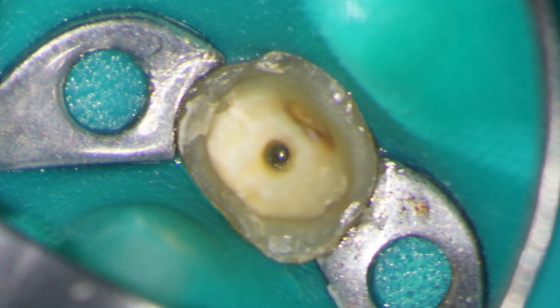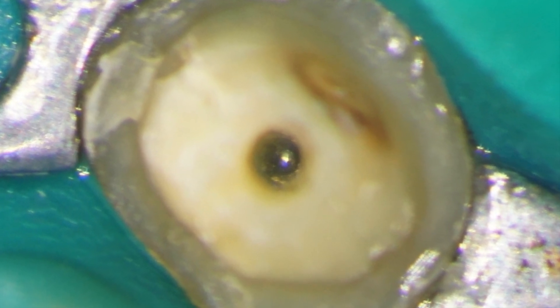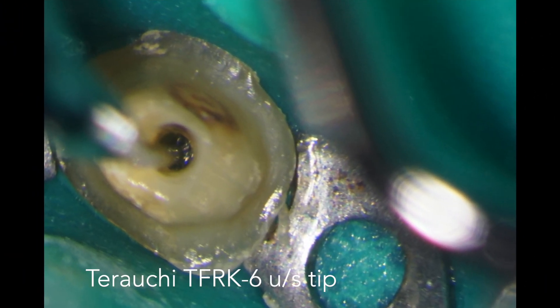Under high magnification you can see the piece of fractured instrument and I'm now going to use a fine ultrasonic tip to vibrate the lateral aspect of the file. In this case I'm using a Terauchi TFRK6 tip in a Pison ultrasonic unit set at about 6.